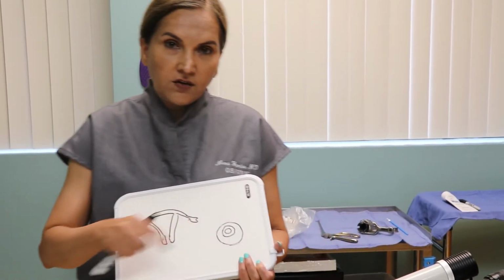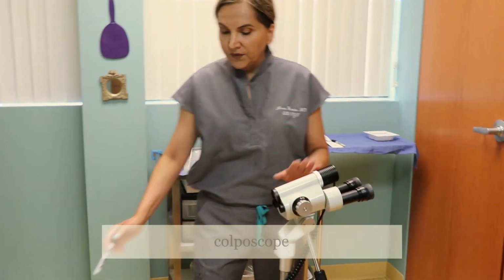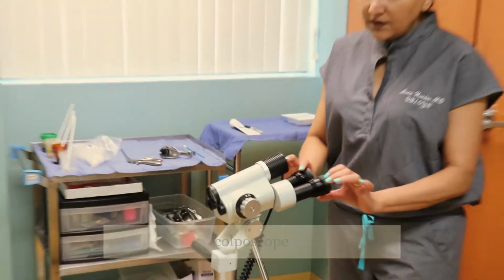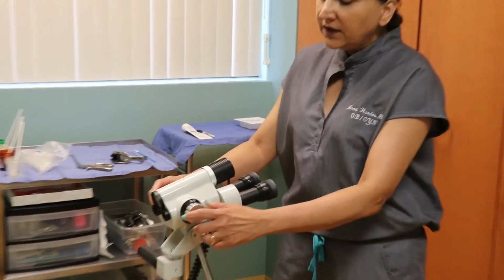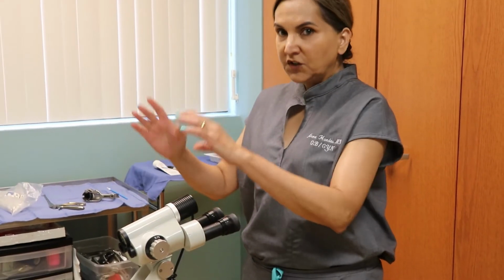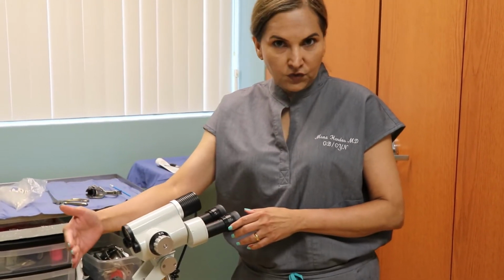So now this area I cannot see with my eyes. So what I use is an instrument called a colposcope. This is a colposcope. Basically it's a microscope. You can see that it has got eyepieces which we can adjust depending upon our eyesight. This is for magnification, and you come in. I'm going to do like a pelvic exam. The speculum is in you, and this gets focused on the cervix.